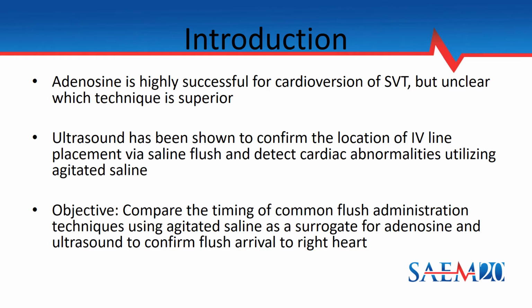As ultrasound has been shown to effectively confirm IV placement as well as detect cardiac abnormalities using agitated saline, we decided to use this in our study. Our objective was to compare the timing of three documented adenosine flush techniques with agitated saline being a surrogate for the adenosine, and ultrasound confirming the arrival of each flush to the right heart.